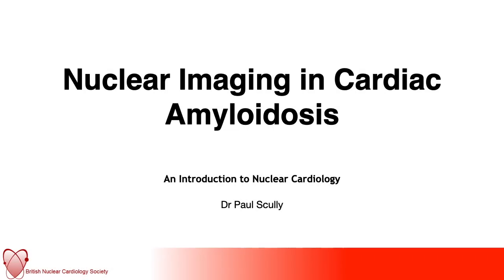So hello again, my name's Dr. Paul Scully. I'm one of the cardiology registrars at Guy's and St Thomas's, and in this next instalment of our Introduction to Nuclear Cardiology course, I'm going to talk to you about the role of nuclear imaging in the diagnosis and workup of patients with possible cardiac amyloidosis.